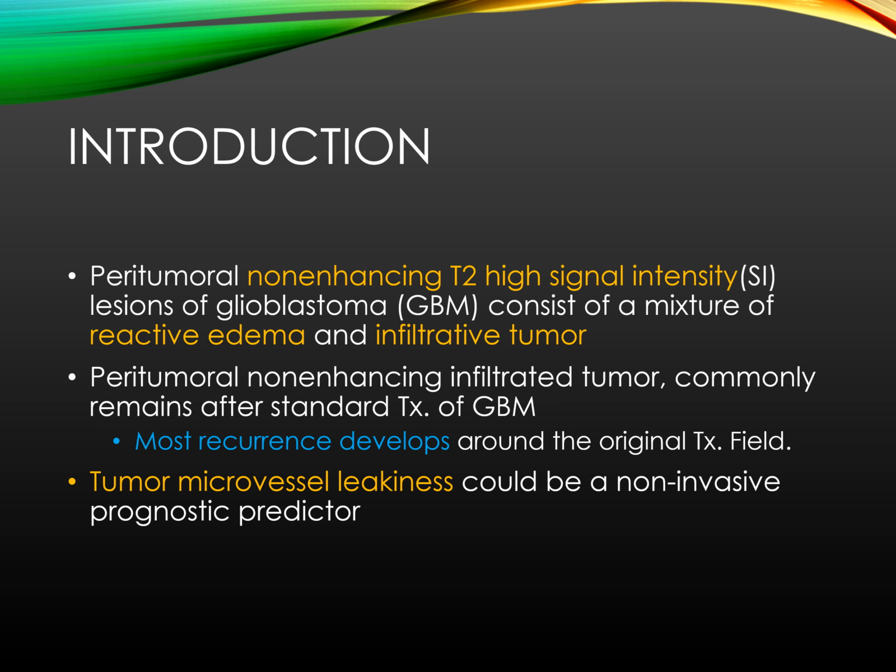Peritumoral non-enhancing T2 high intensity lesions of GBM consist of a mixture of reactive edema and infiltrative tumor, and it is difficult to differentiate them on conventional morphological images. Peritumoral non-enhancing infiltrated tumor, which shows high signal intensity on T2 weighted image, commonly remains after standard treatment of GBM, and most recurrence develops around the original treatment field.